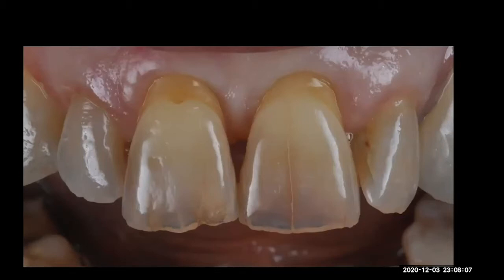So I requested the doctor to put in an intraoral mirror, because I was curious why that opal effect was so strong in those teeth. When I looked inside the mouth at the palatal side of the centrals, I saw that the patient grinds away completely the dentin that the teeth have in lingual, and leaves only the buccal part of the tooth.